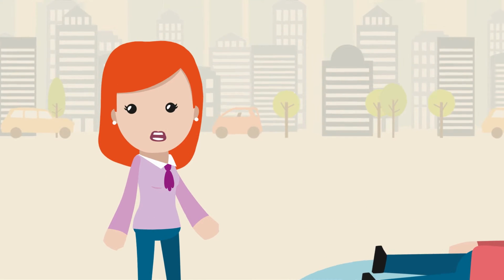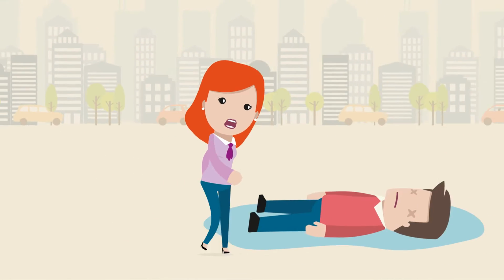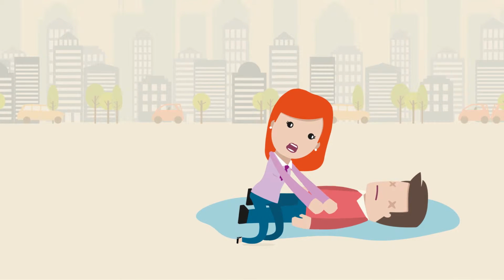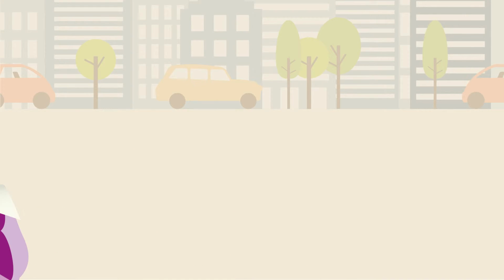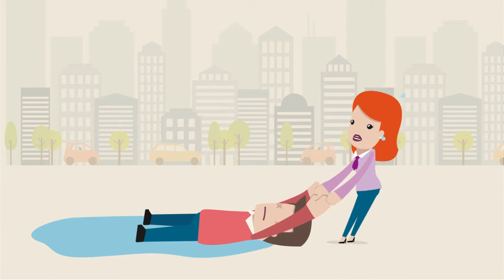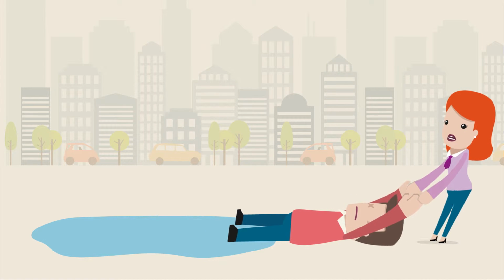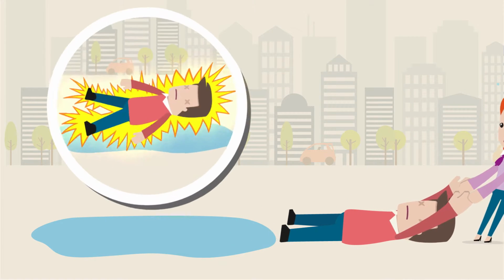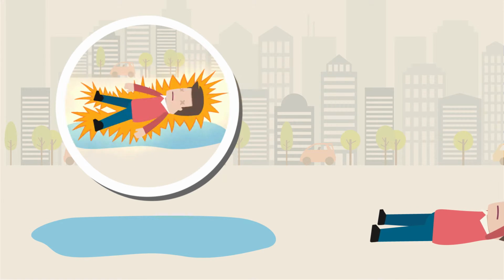Look out for any possible danger that could affect you, your casualty, or passers-by. Then try and wake the person, and if they do not respond, call 999 or 112 from your mobile. Then shout for the Mediana A15 AED. If the casualty is at risk of further injury or in contact with water, carefully move them to the nearest safe and dry place. Remember, stay away from any wetness when delivering shocks, as water conducts electricity.